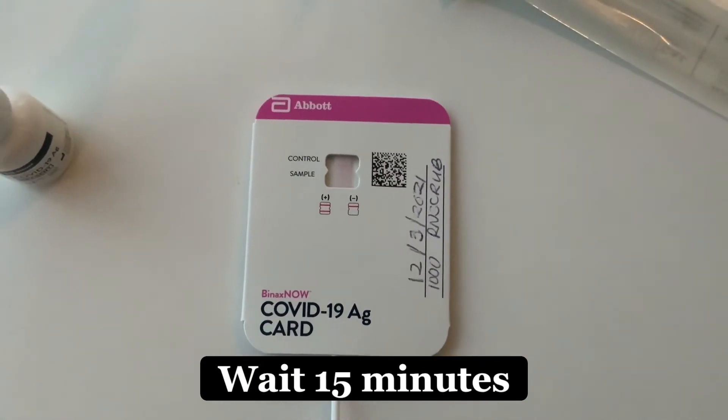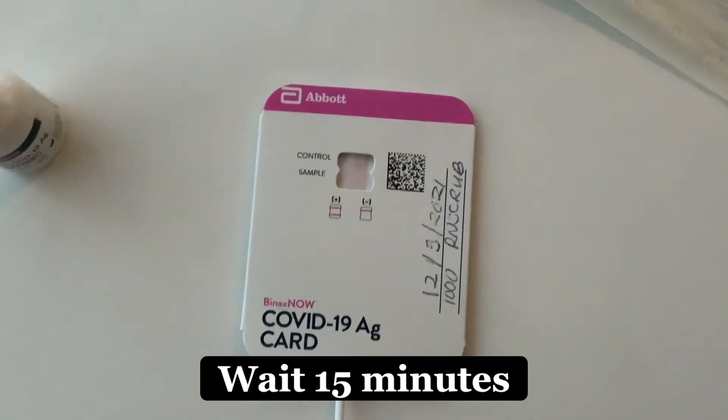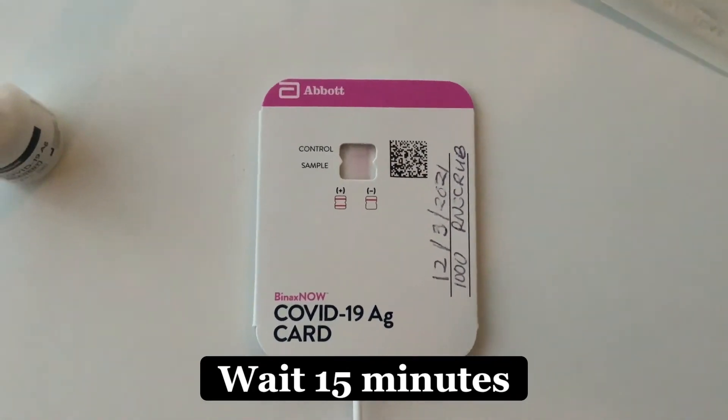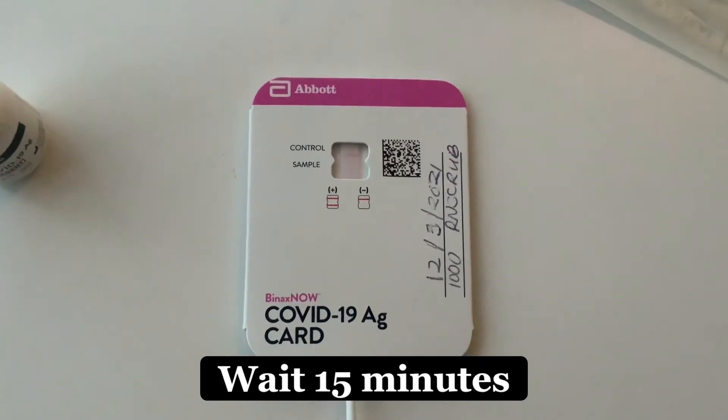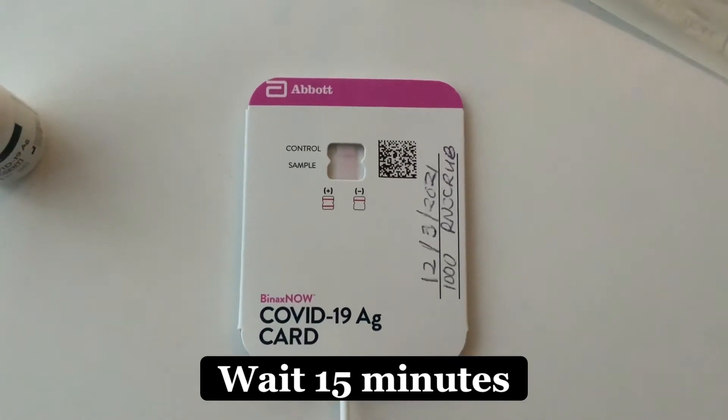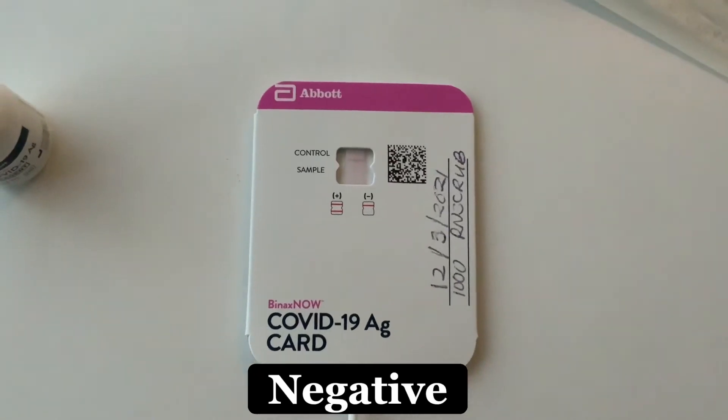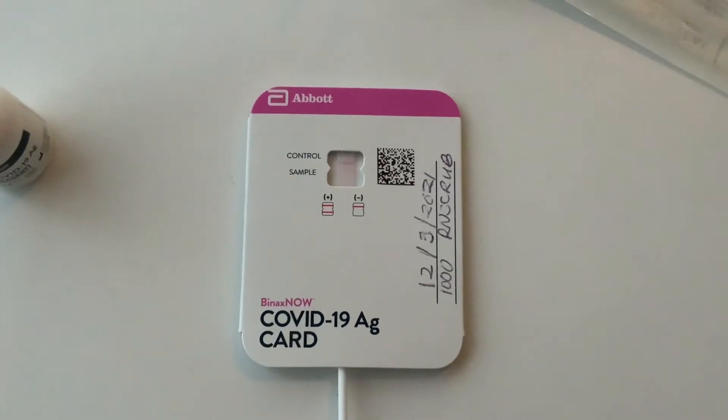And then after 15 minutes, you're either going to see a positive or a negative. So the positive is going to be two lines, and the negative is going to be one pink line straight across. And as you can see here, time-lapse, this is a negative result.